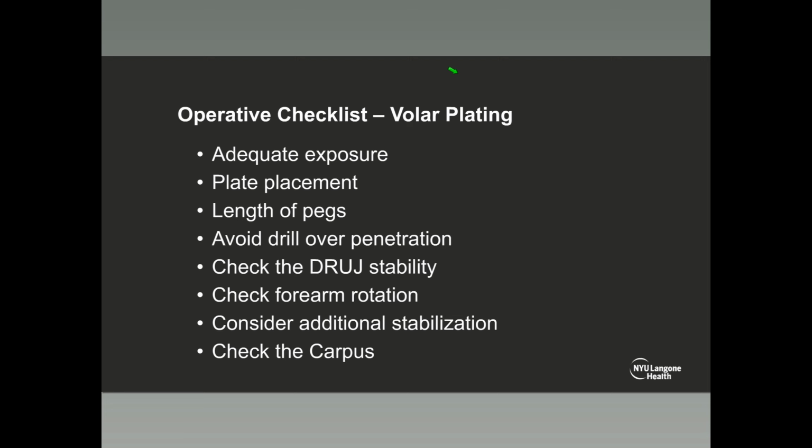Always check DRUJ stability after you're done with the volar plating. You want to check forearm rotation. Make sure there are no screws that have penetrated into the DRUJ that are going to block forearm rotation. Consider additional stabilization, and we'll talk a little bit about what that means.